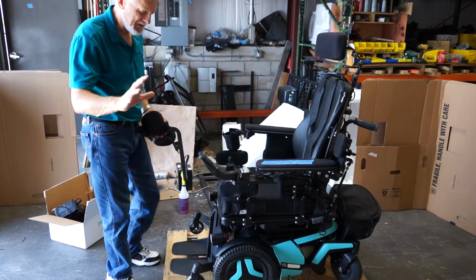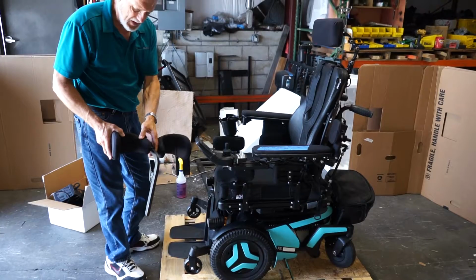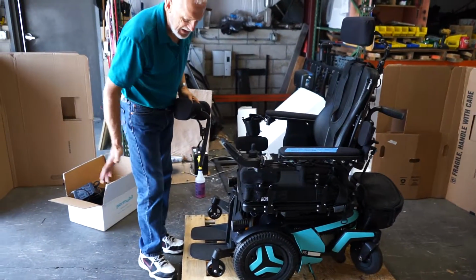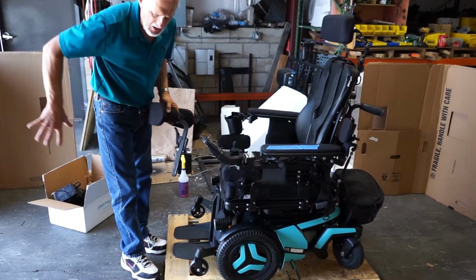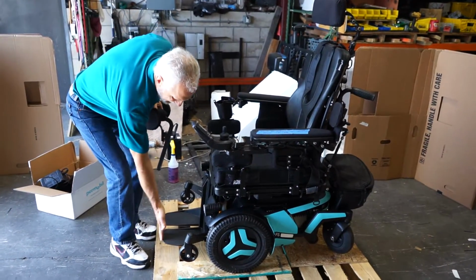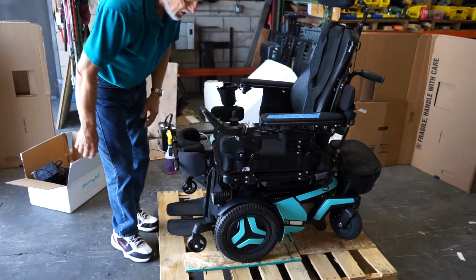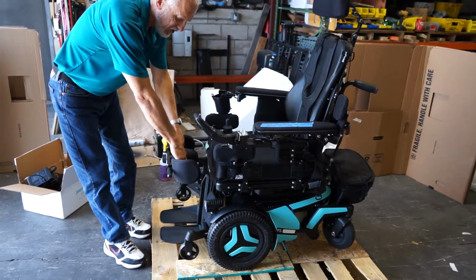All right, I'm sending you this quick little video to give you a heads up on the chair. When you put the knee brace on, always make sure the legs are in. The feet, they're not out with the patient in the chair, because it's hard to slide these in. So have the feet retracted in, then you can slide this onto his feet. His knees will go in here.